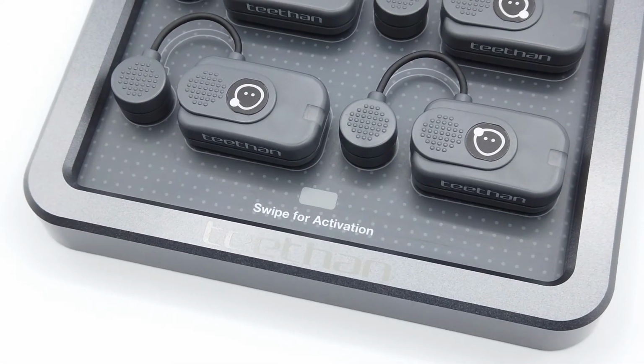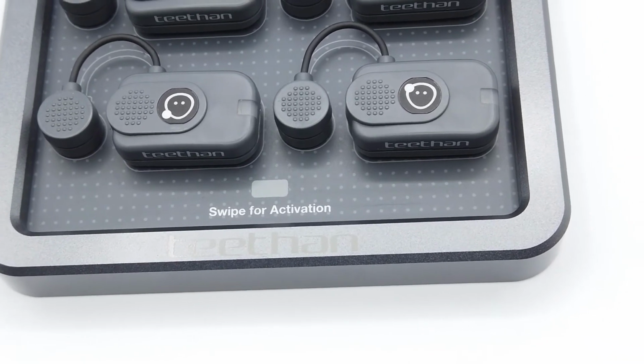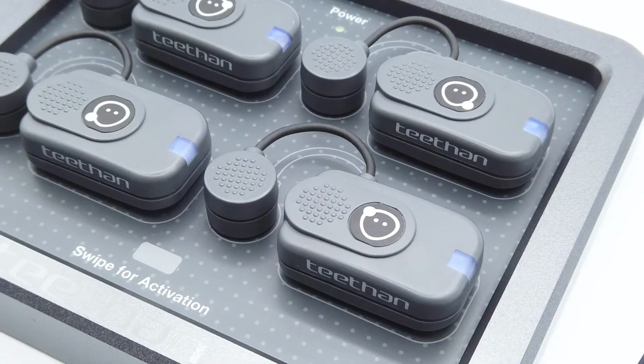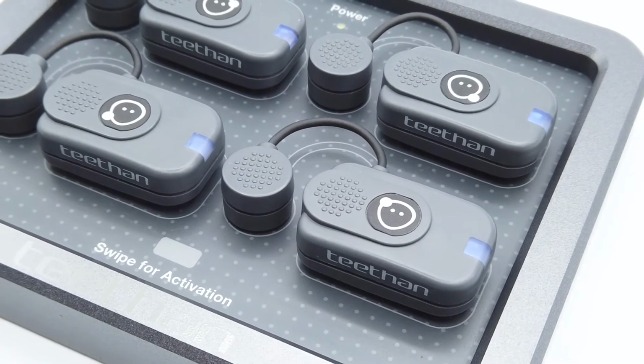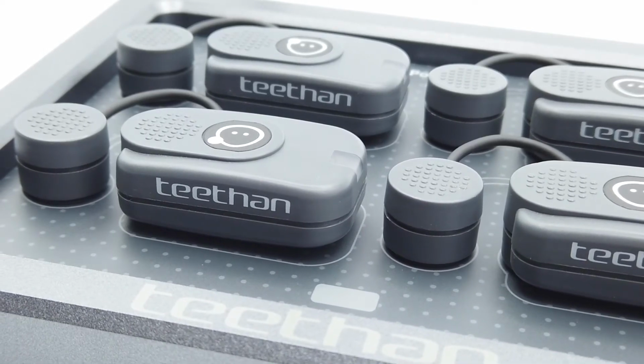To charge the probes, please reconnect them to the charger and plug it into the laptop via the USB cable. The LEDs are blue when the probes are charging and the battery level is less than 90%. The LEDs will turn off when the probes are fully charged.